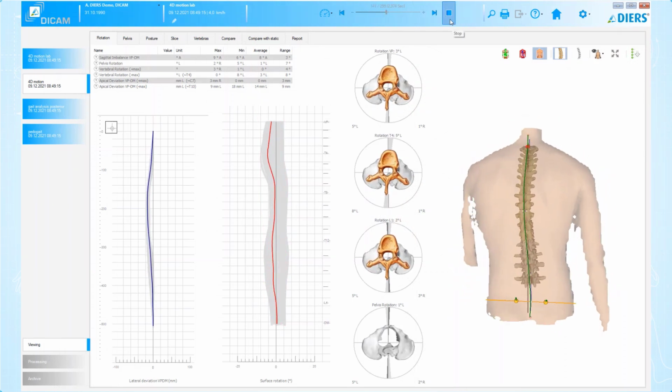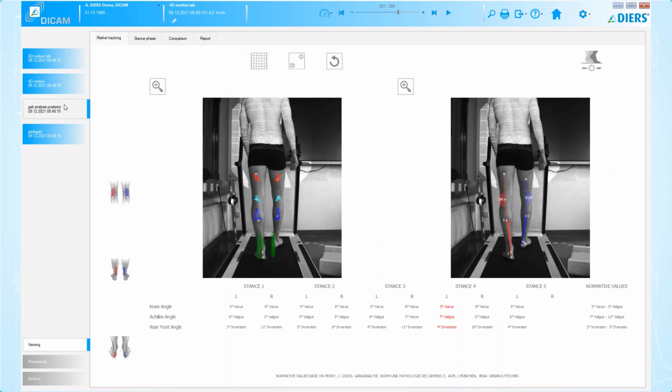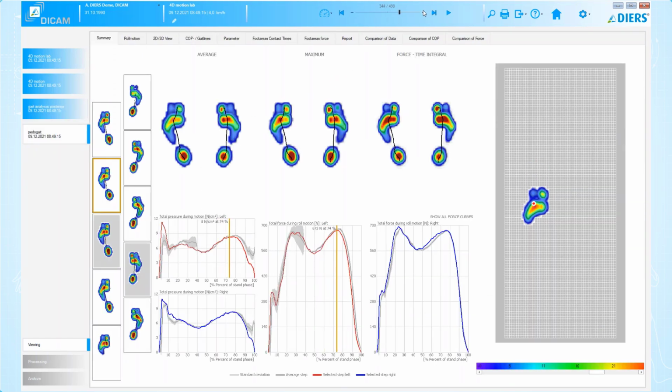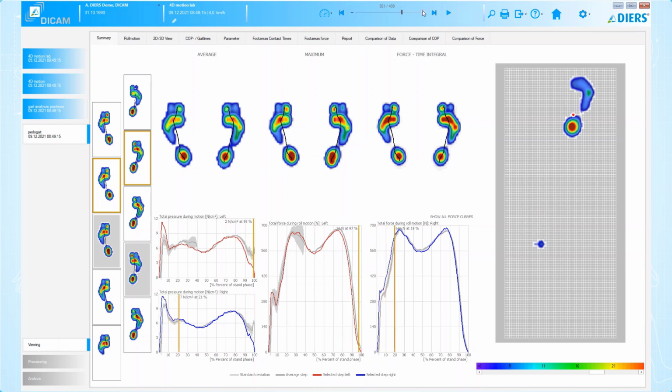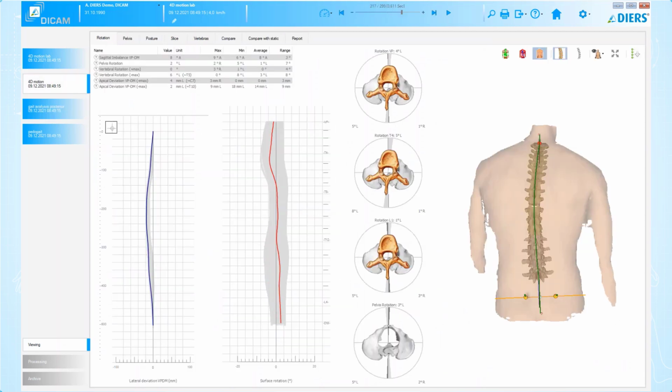For this purpose, a specific point in time with an observable gait deviation is determined via the video control at the pedobarography or the video gait analysis. Switching back to the 4D motion then shows the exact spinous process rotation at the defined point in time. A red graph with local outliers or visible twists can provide a direct segmental reference to known symptoms.